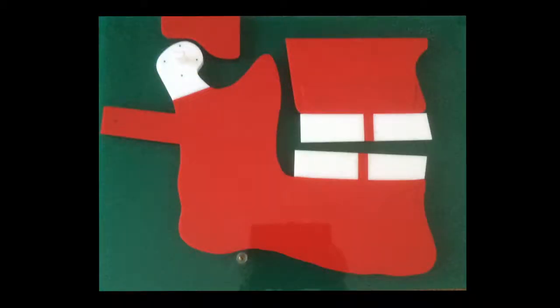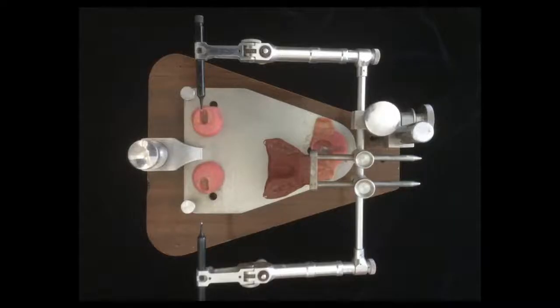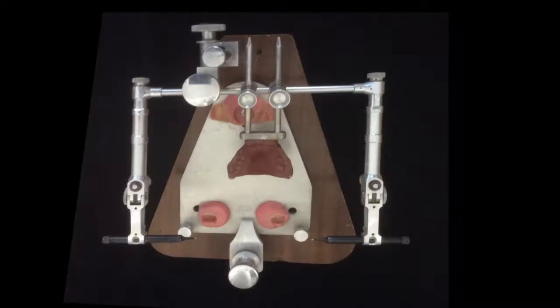The ear bow face bow, which is the commonly used face bow today, is an approximation of where the axis hopefully is. This is the adjustable face bow and mounting jig which my dad designed and we used routinely. It only takes a few minutes to locate the real axis, and it is so very much worthwhile.